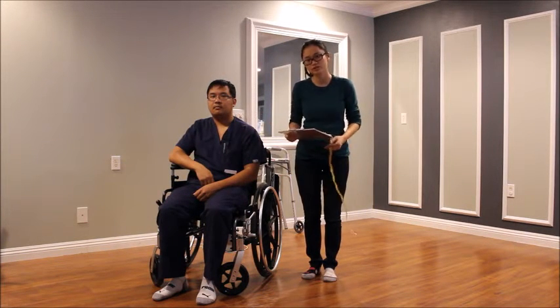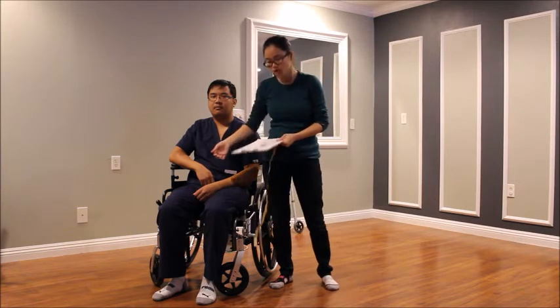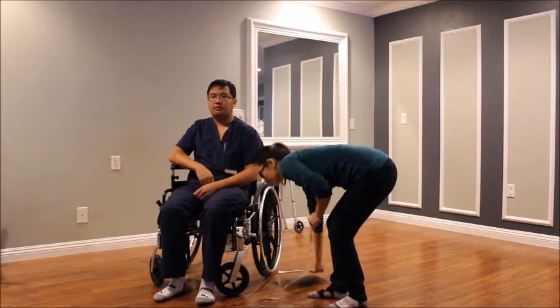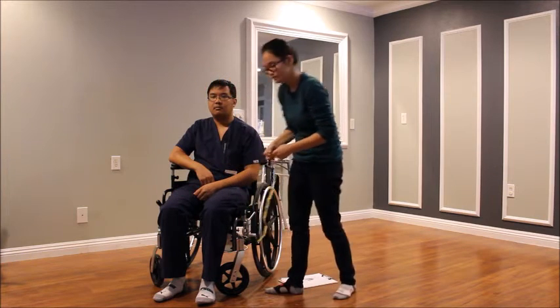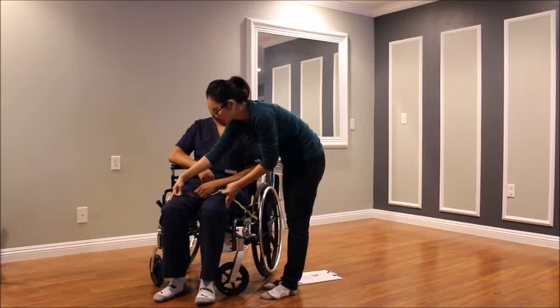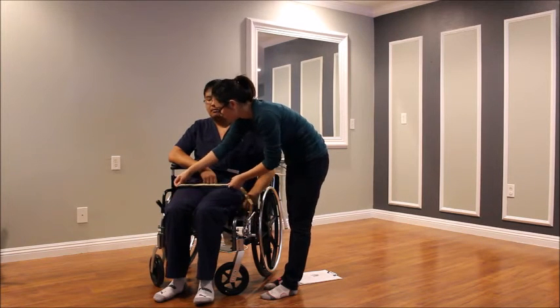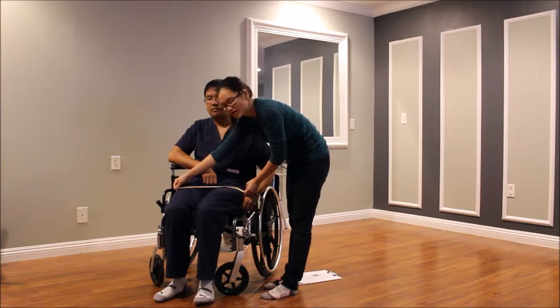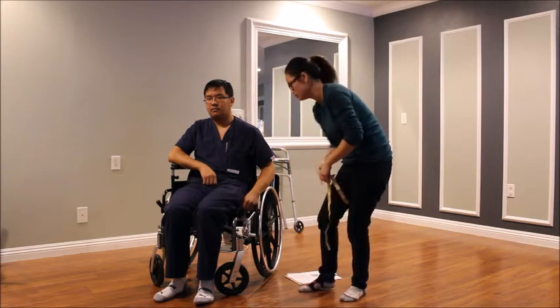First, we'll measure the seat width. So what you do is you measure the widest point across the hips or the thighs. For him, the widest part would be around the thighs area right here. So all the measurements are in inches, by the way. Okay. So that's about 16 inches, and usually you add 2 extra inches just for comfort when sitting down.